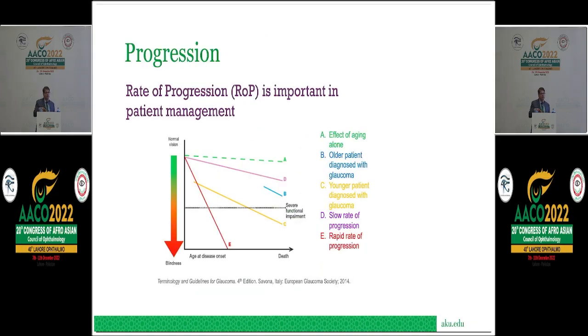Just like with visual fields, sometimes you want to repeat it to make sure, depending on the quality of the scan. But if you see, for example, a notch and the RNFL confirms that, or the ganglion cell complex, then you don't necessarily have to repeat it. Many guidelines talk about an average change over time in the ganglion cells, but if it's going slow, it's not a problem. But then there's a line, and when you lose ganglion cells beyond this critical amount, you're starting to have an effect on the quality of life and the function.